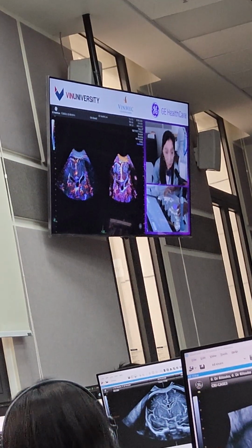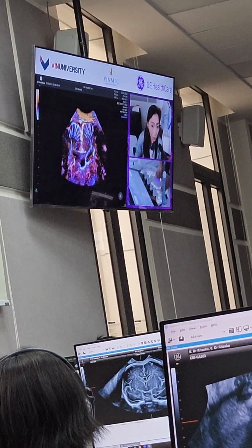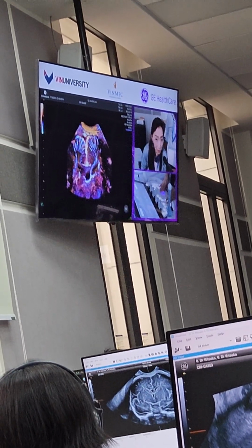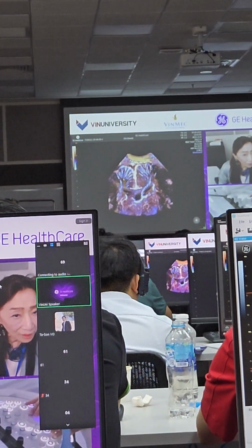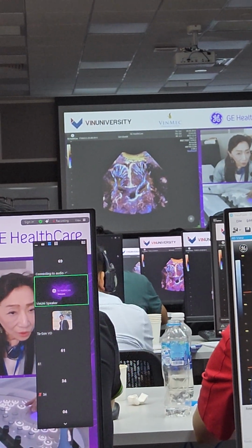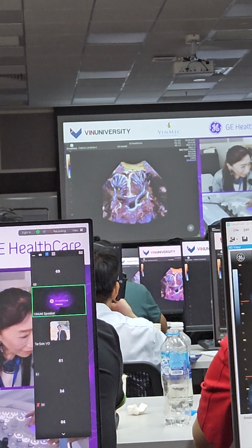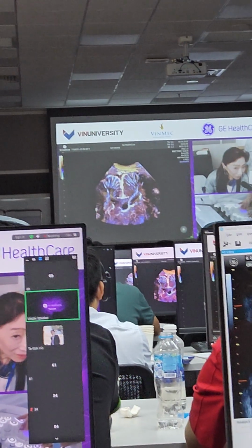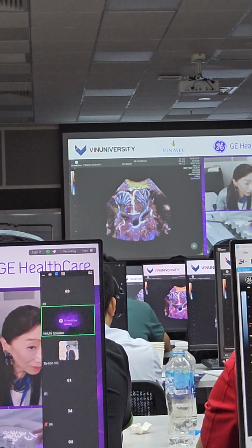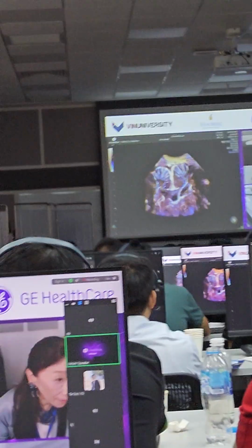In the normal case, those are the medullary veins, and the medullary veins here, it's cut here, right? So usually in normal, at 25.6 weeks of gestation, that is going to continue to this big vein.